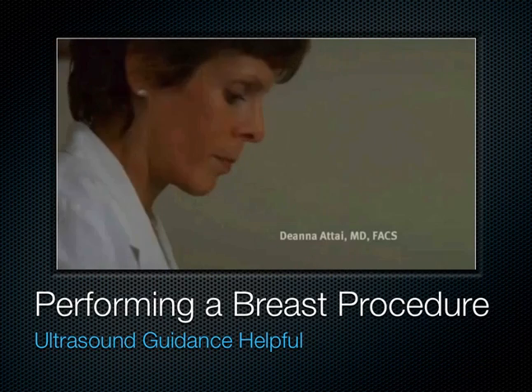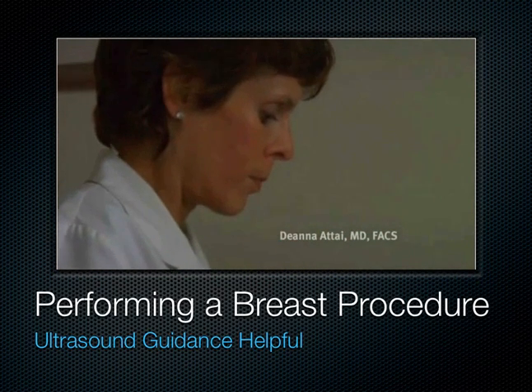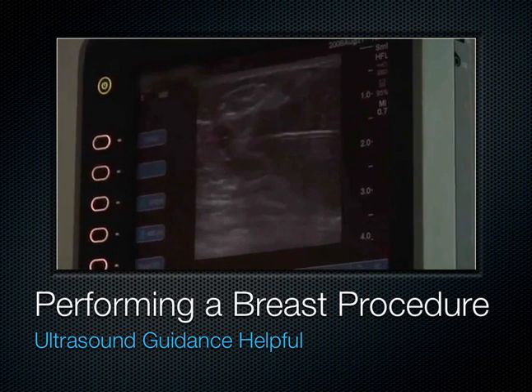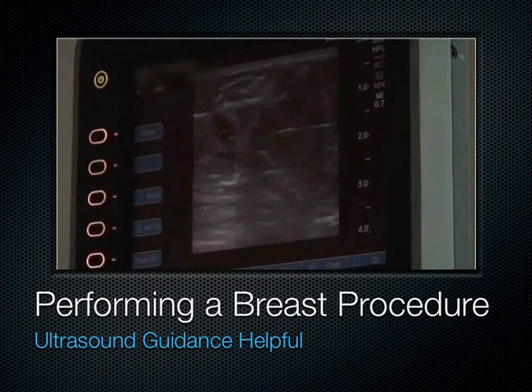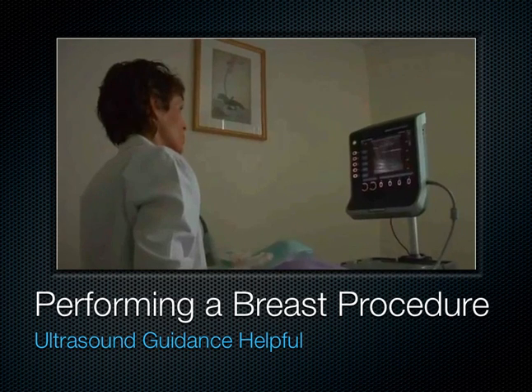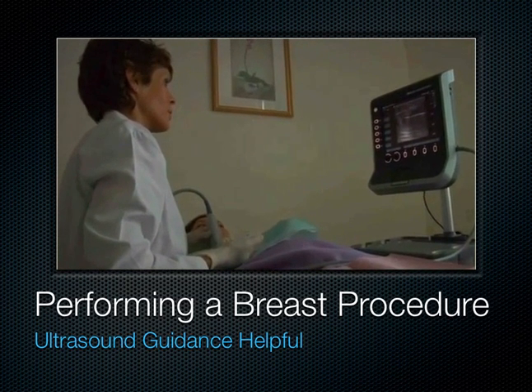Now basically what we're doing initially is just putting numbing medication in, and so we'll numb up the skin of the breast and then the underlying breast tissue. Do you feel this? A little bit. Yeah, this is on the other side of it. It's on and off. Okay. If you look up on the screen, you can see the fibroadenoma to the right, and then the numbing medication's gone all the way over to the back side right there.